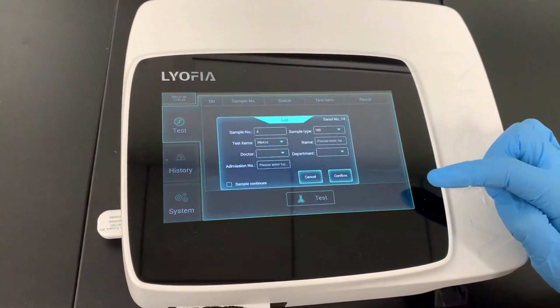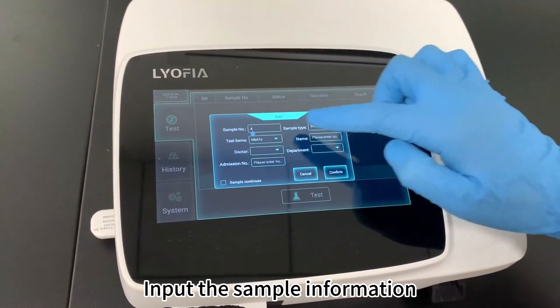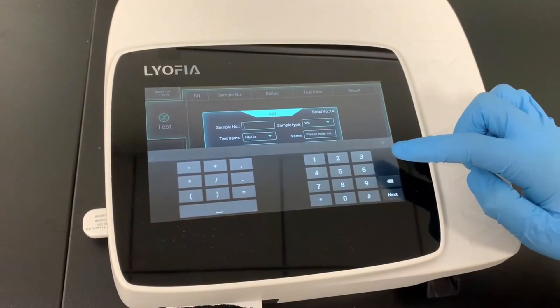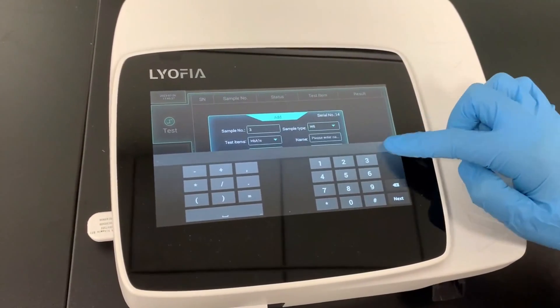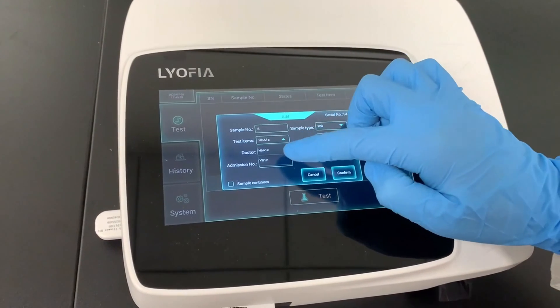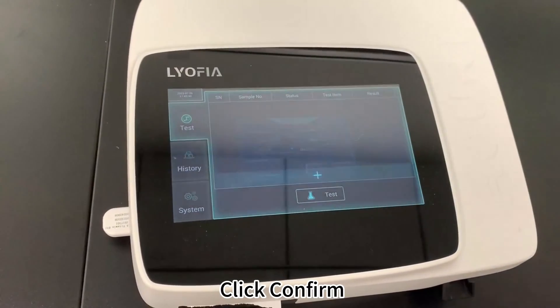Click Plus. Input the sample information. Click Confirm.